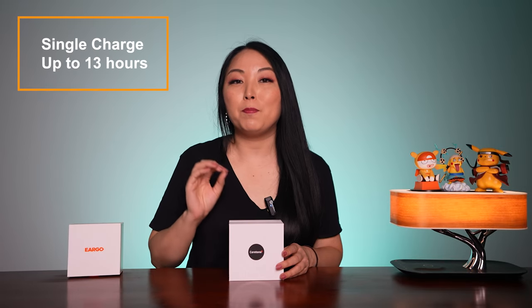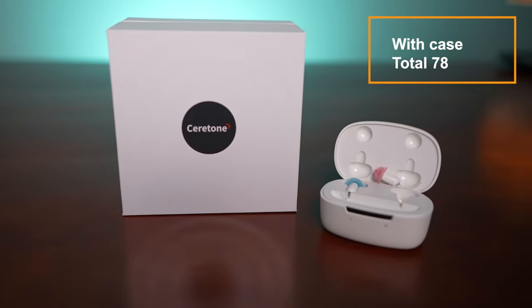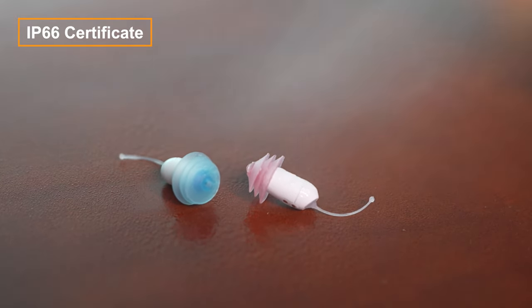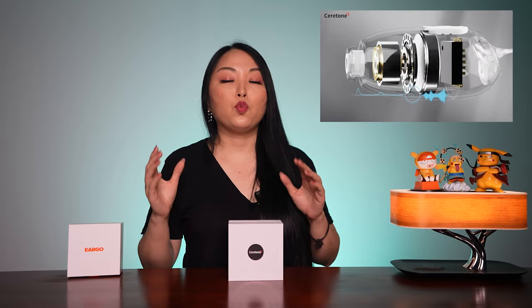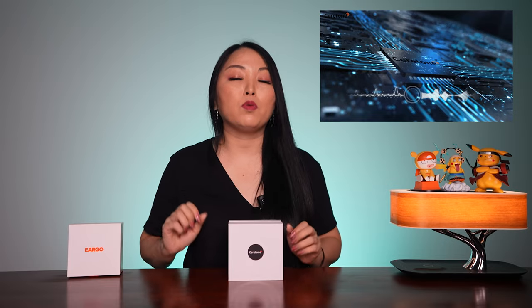For battery life, with a single charge you can use them up to 13 hours, and with the case a total of 78 hours. For protection, it comes with IP66 certification — no worries about rain and sweat. Now let's talk about sound. Core One has a dynamic drive that will automatically reduce noise and deliver clear and stable sound.